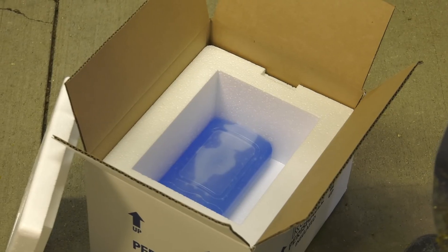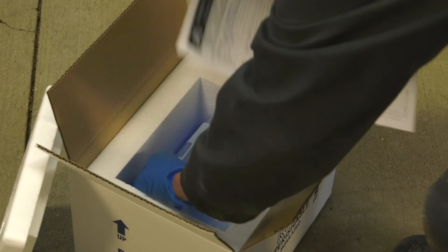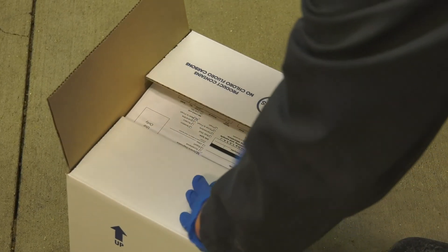Once you are finished collecting all your samples, secure the tubes in the cooler with enough ice packs to maintain a temperature between 32 and 40 degrees Fahrenheit or 0 and 4 degrees Celsius. Secure the lid on the cooler with packing tape, and include a completed submission form and the appropriate mailing information.